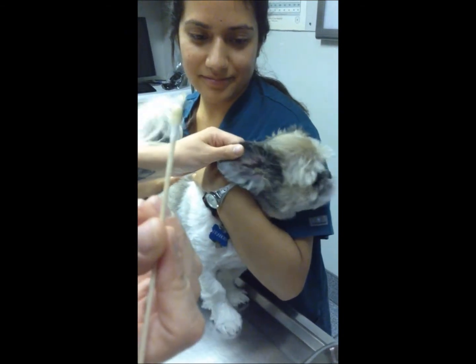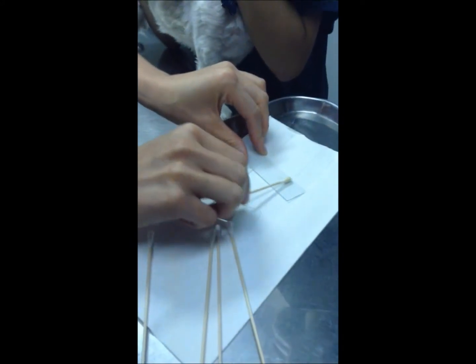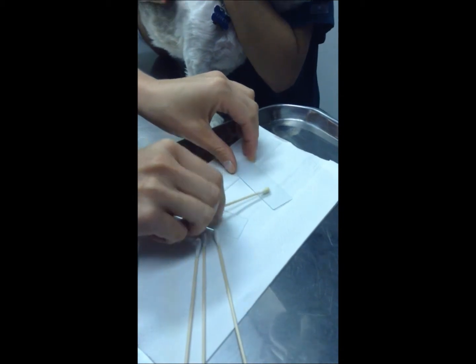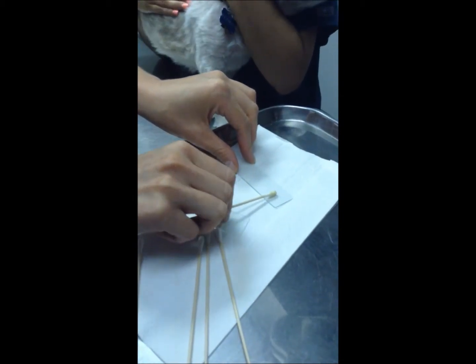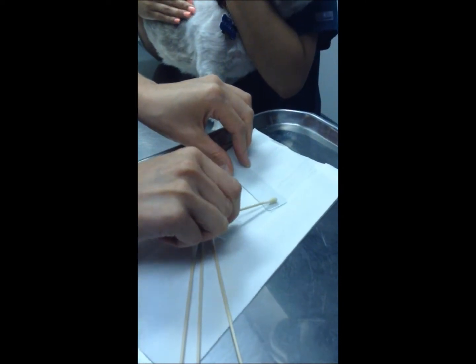So there's lots of gooey stuff on there. And we're going to place it on a slide. You're going to roll it. And with the ear cytologies, you heat fix them before you stain them.